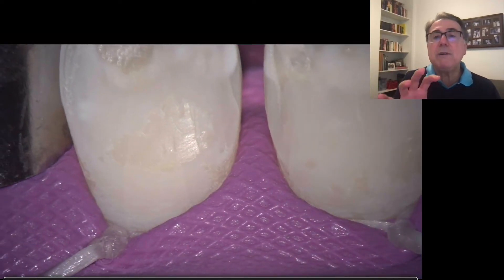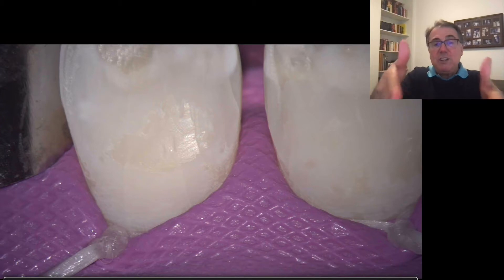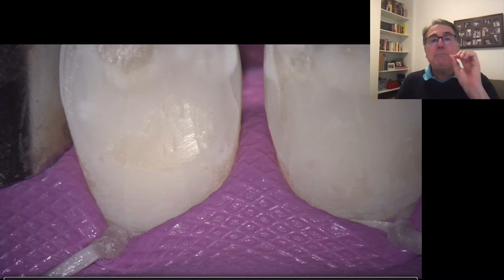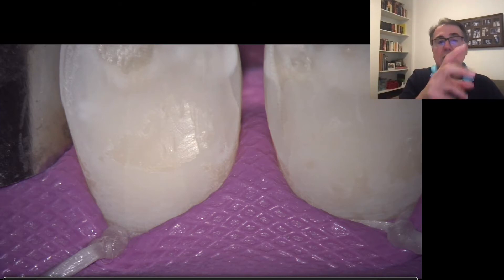There's a lot of composite — not just on the buccal surface, but close to the gingiva, close to the rubber dam. Some may think, well, you can bond a new composite on top of the old one, but not like this. To bond a composite on top of enamel, you will have a much better result in terms of long-lasting restoration than if you do your restoration on top of an old composite. The longevity will be better if you bond your restoration onto the tooth structure, not onto the old composite.